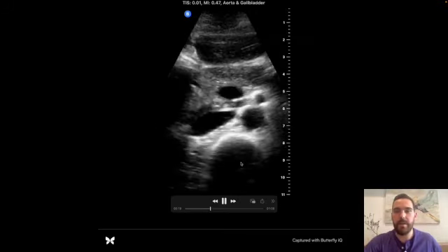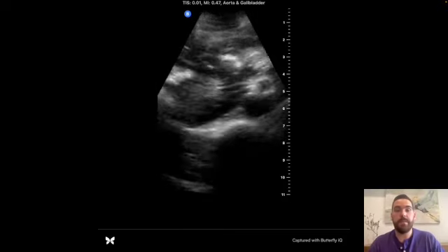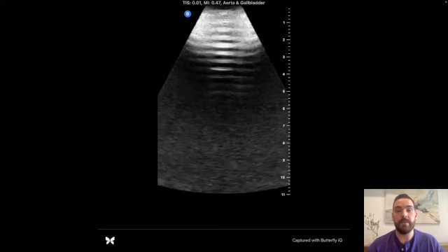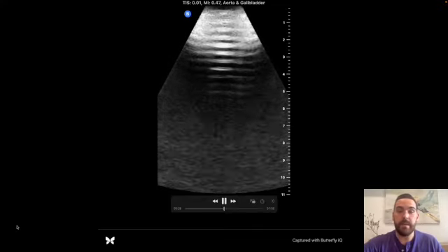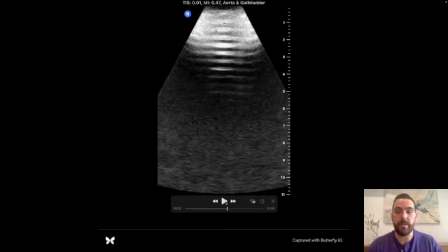Now, the interesting thing is that below this point, or below the kidneys, about 80 to 90% of abdominal aortic aneurysms occur. That's an important metric for us to be aware of as we're scanning our patients, to know that most of the aortic aneurysms occur below this level. Not to say that they can't occur above, but that's just the statistics on that.